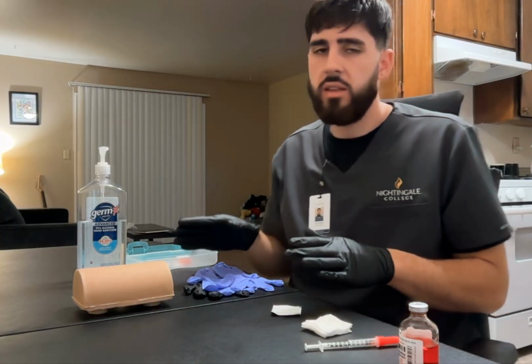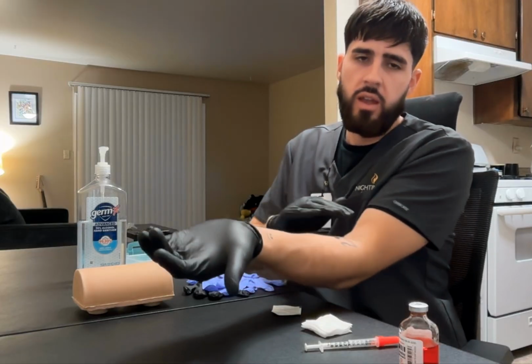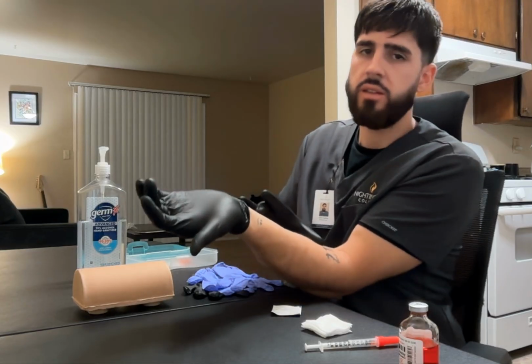Now I'm going to locate the site of the injection for my patient. It's going to be on his inner forearm. It's going to be 4 finger lengths down from the bend of the elbow and 4 finger lengths up from the wrist in this section here.